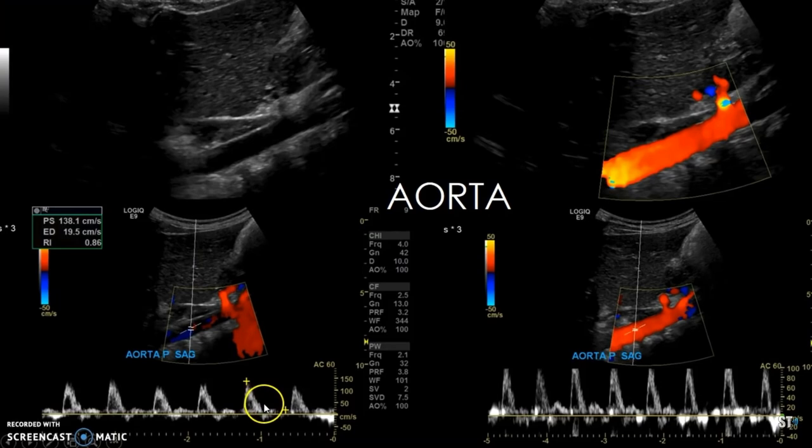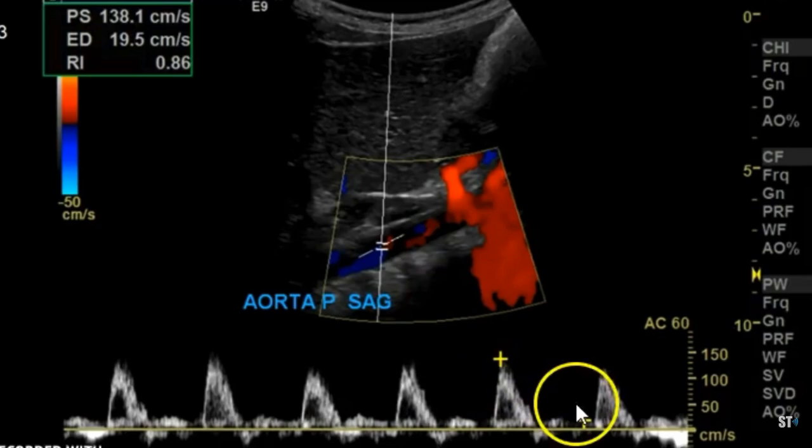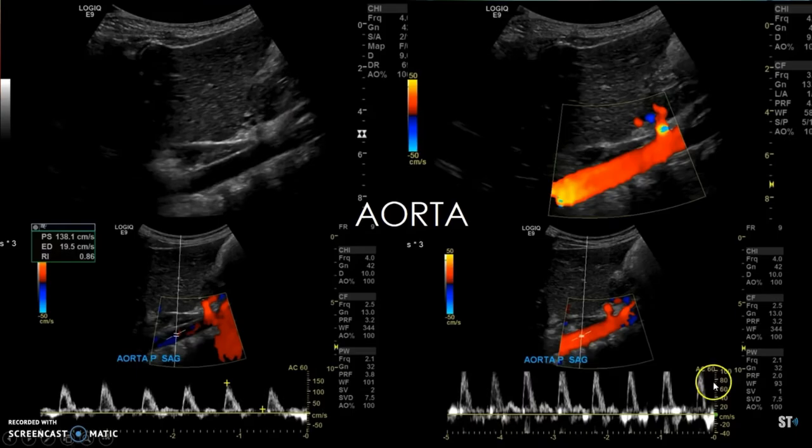You want to make sure your scales are set correctly. Here you can see it's aliasing — that's not a good scale. And if it's too low, that's also not a good scale. So sweep speed and scale, you want to make sure that they're set correctly.